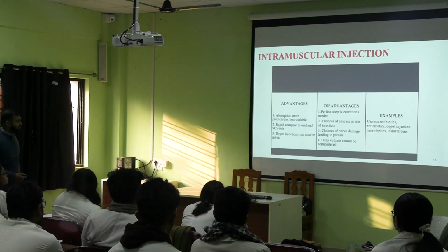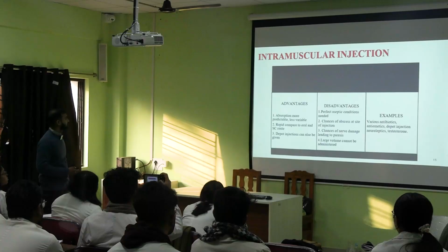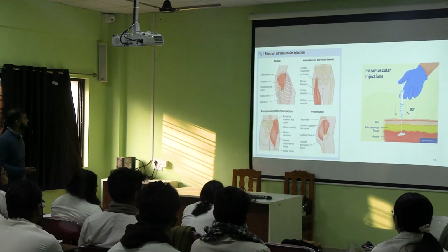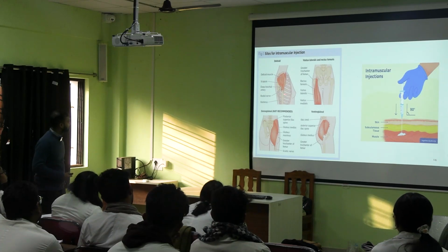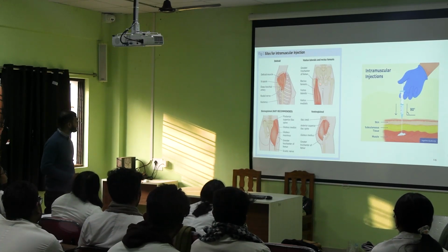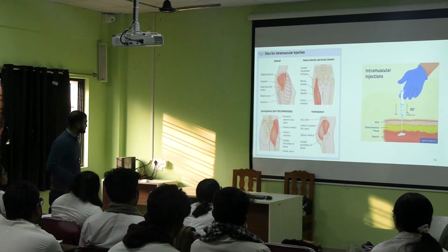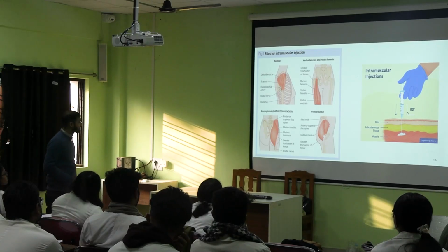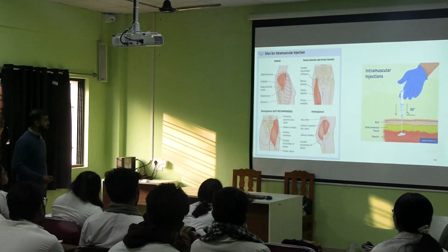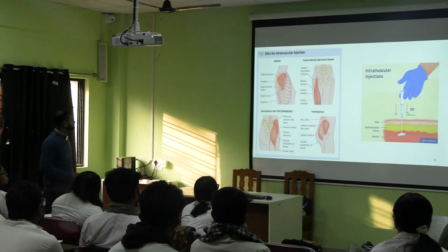Examples such as antibiotics, antiemetics, neuroleptics, testosterone are commonly given by the intramuscular route, okay. So what are the sites? This is the deltoid, then the vastus lateralis, then the gluteus maximus, then the ventrogluteal site. Usually the dorsogluteal site is not recommended, okay. It has to be exactly 90 degrees when you give the injection.